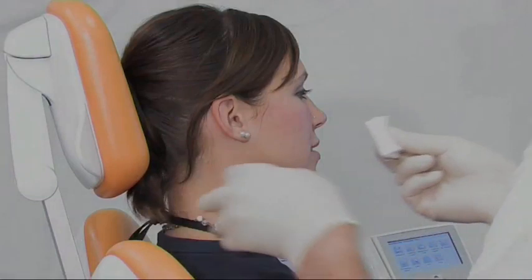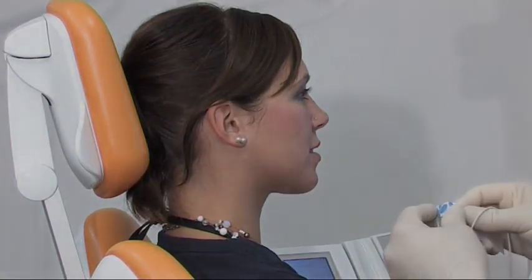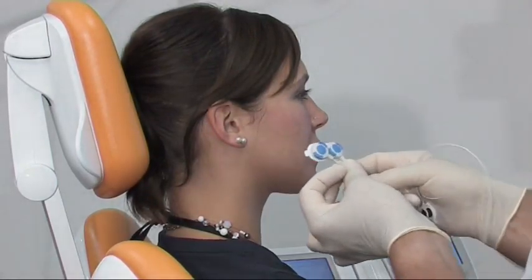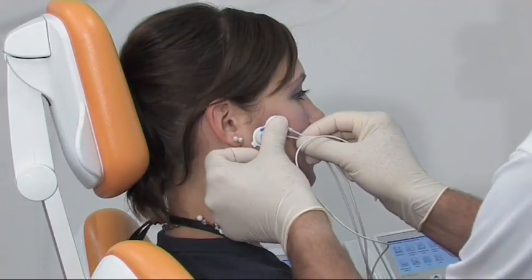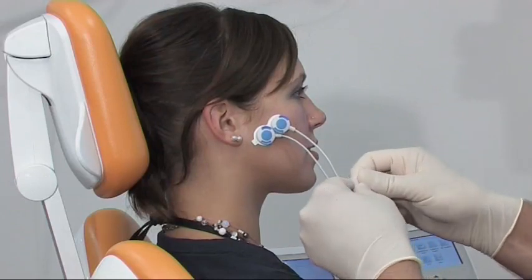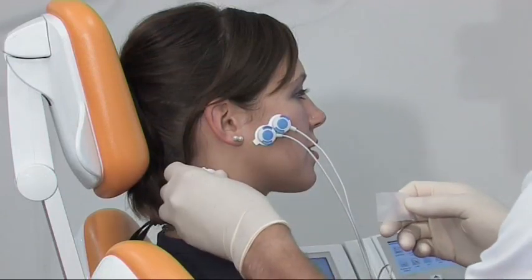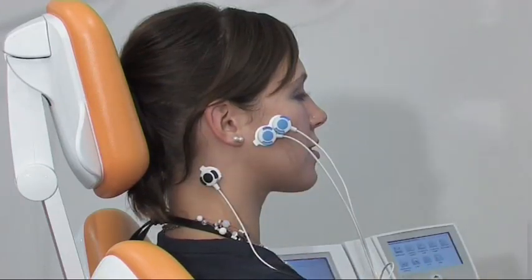We prepare the locations for the electrodes by cleaning the skin and removing dead surface skin cells in the areas of the active as well as the neutral electrode. The electrodes are adhered to the muscle structure so that the gel has good contact with the skin. The neutral electrode is attached behind the ear. We have to do the same on the other side for the second pair of electrodes.